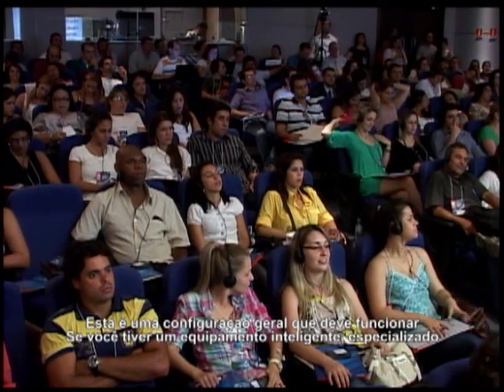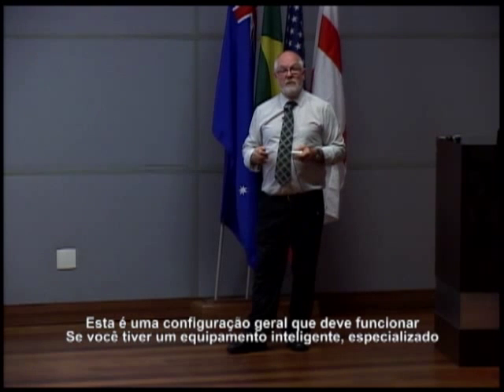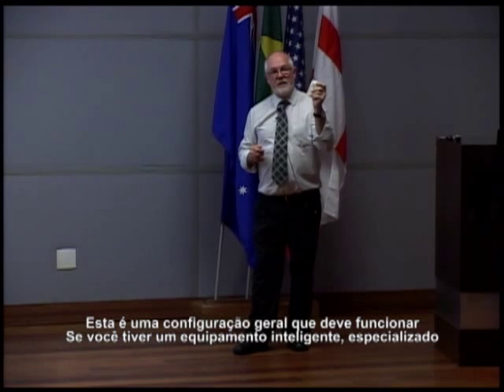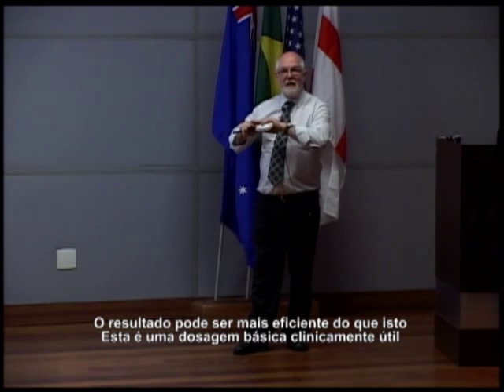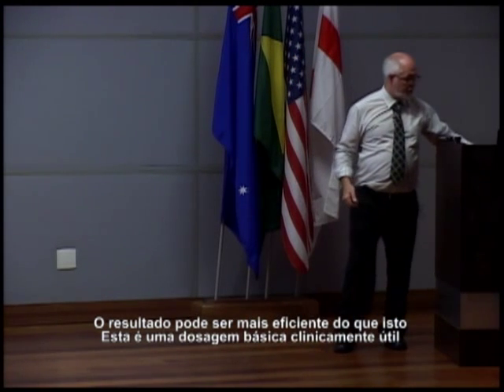All right? That's a general setting that should work across. If you've got a clever machine, if you've got a specialized machine, you can be more effective than that. But that's a basic dose which will be clinically useful.